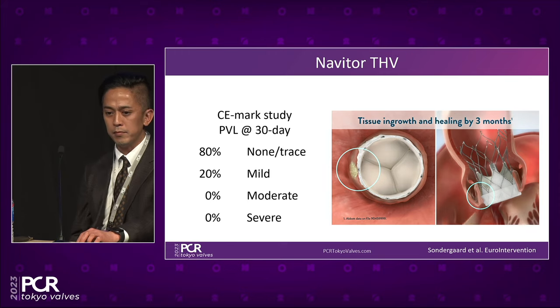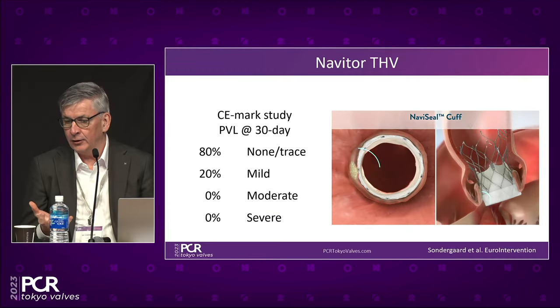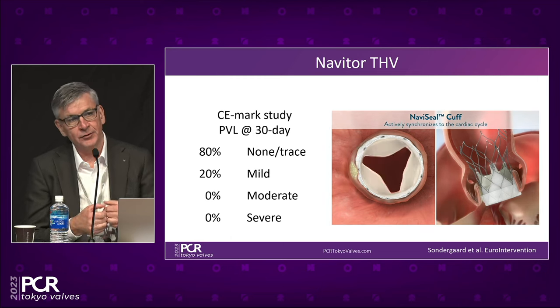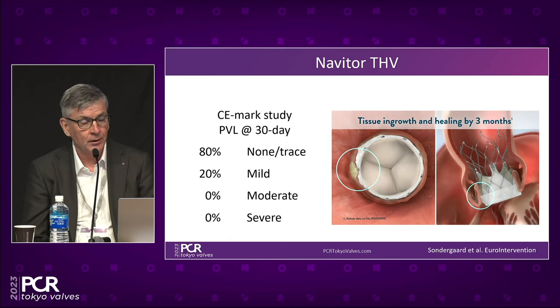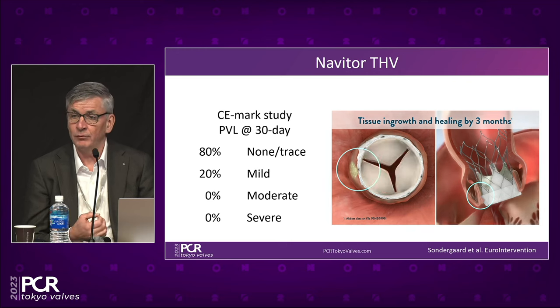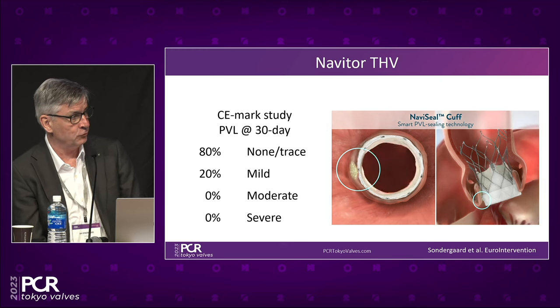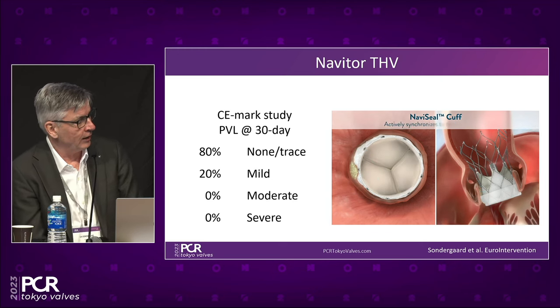Yeah. And I also think it's fair to say that with most of these new generation valves with this external shield skirt, paravalvular leak is not the same issue as it used to be. And again, as I said before, talking about radial force doesn't make a lot of sense. It's the opening force which is different, and you can compensate by doing a predilatation. On the other hand, low opening force is going to give you a much more flexible system if you have tortuous anatomy. And also notice the case you just presented had quite tortuous access vessels. So why don't you just show us how you actually treated this patient and what the outcome was?